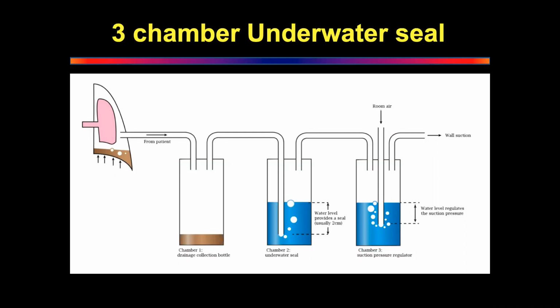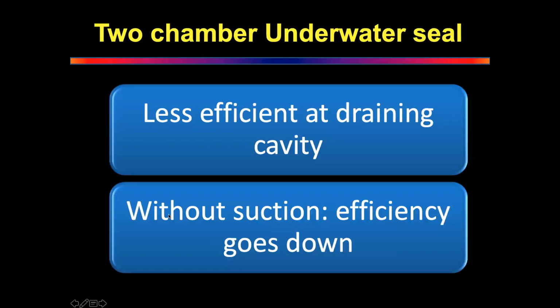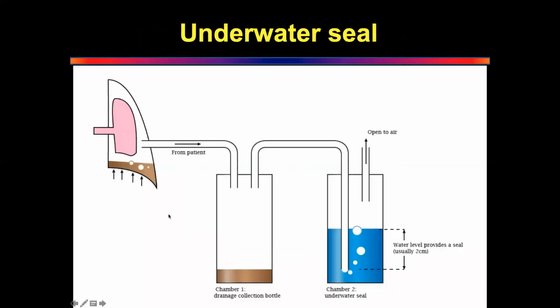Everybody stop. Pitun, did you understand why the 3rd bottle is now different from 2 bottles? I didn't understand even the 2 bottles. Okay, let's go back there. Here, the reason why you put 2 bottles is because the fluid is collecting in a different chamber. Agreed? Happy with that? Yes. Okay.